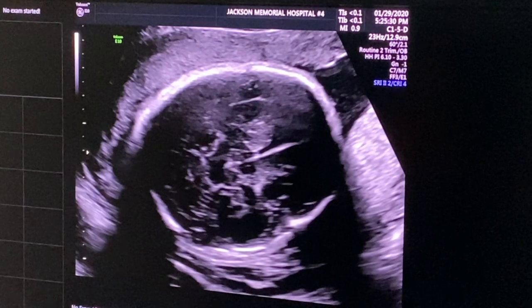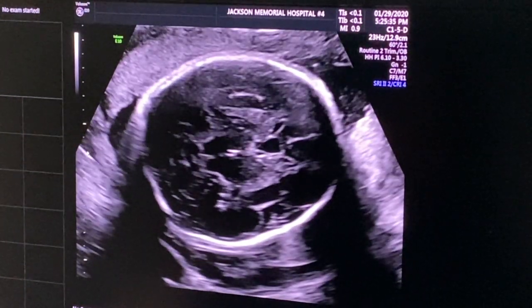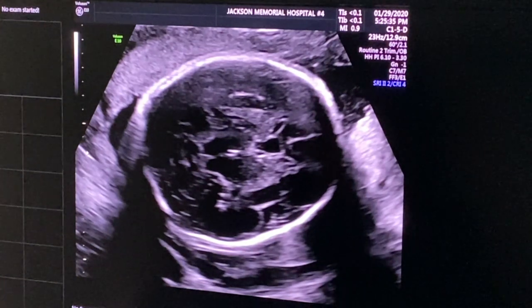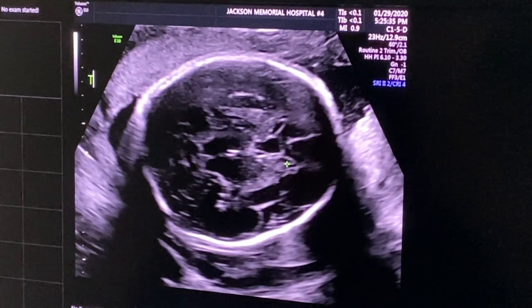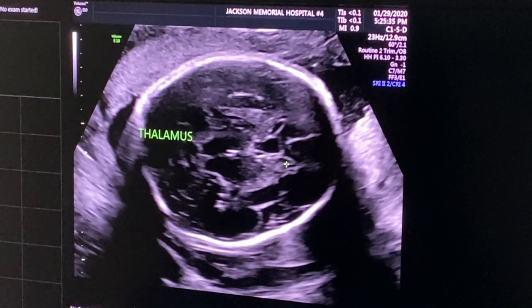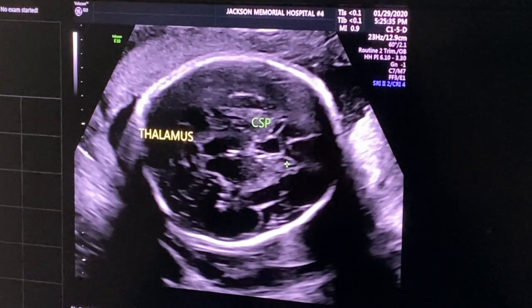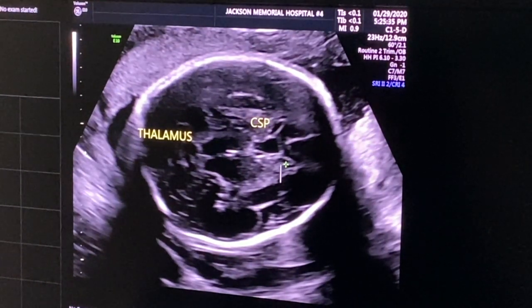Fetal weight can be calculated using the predetermined formula which is programmed into your ultrasound. The biparietal diameter should be measured in a cross-sectional view at the level of the thalami. Sonographic landmarks for measurement of BPD include thalami, symmetric appearance of both hemispheres, cavum septum pellucidum, midline falx, and insula.